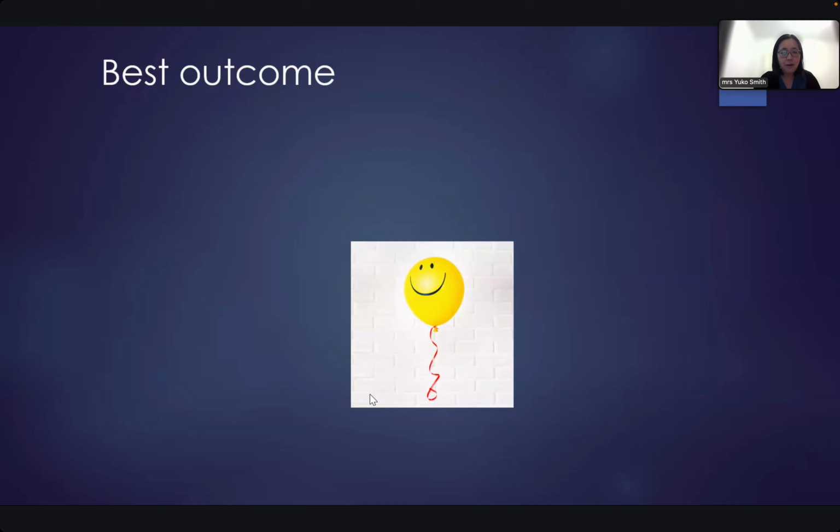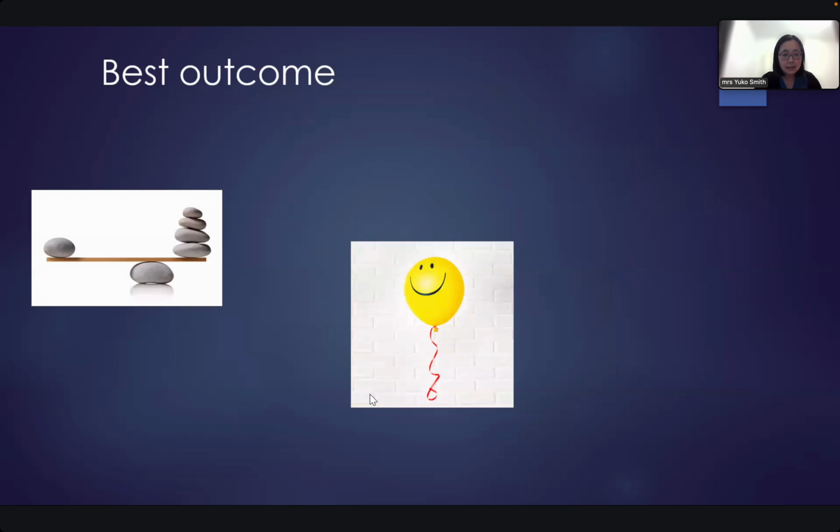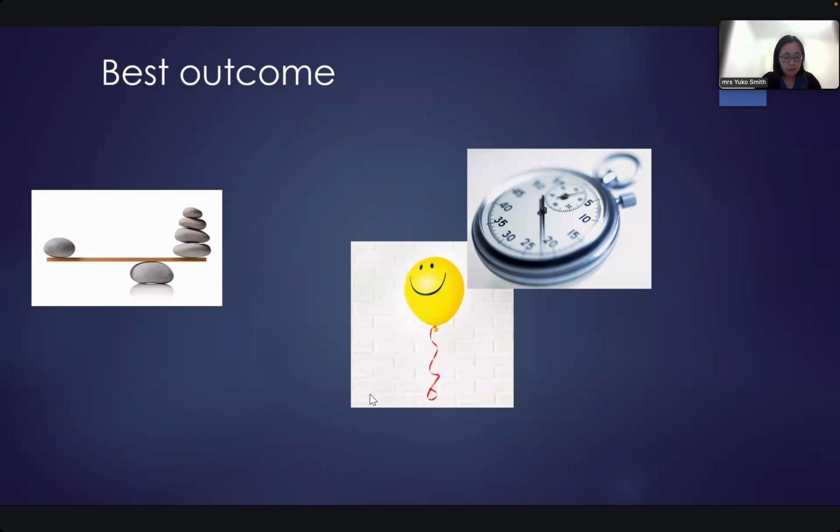So how do we define outcomes in PCNL? Obviously, the stone-free rate is critical for our patients, and this will depend to some degree on the imaging modality used for follow-up. Time, so operative time. In the days of long waiting lists, our managers are keen for us to do each operation quickly and do more operations. And even from a patient point of view, there's a suggestion that keeping your operative time to less than 2 hours may reduce your complication rate.